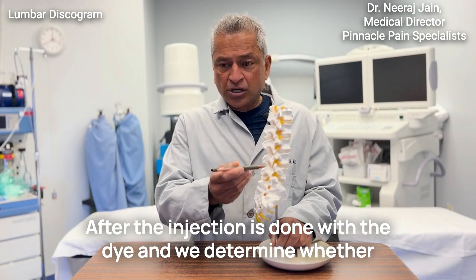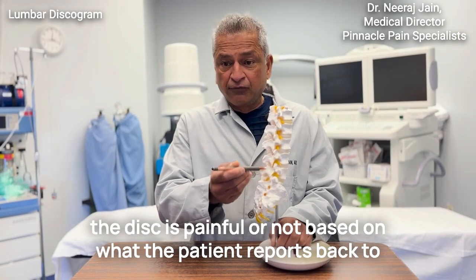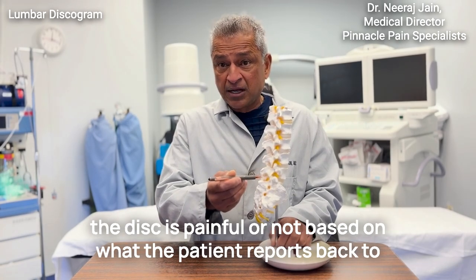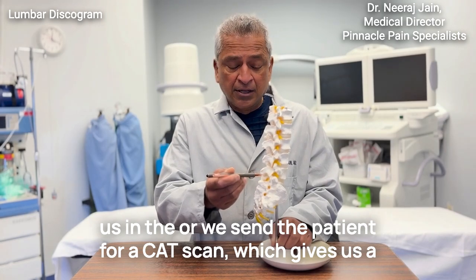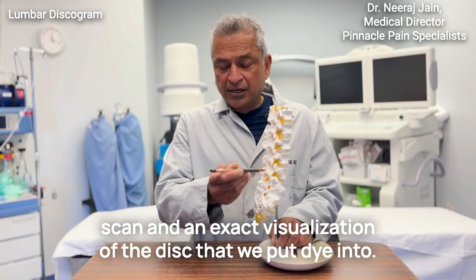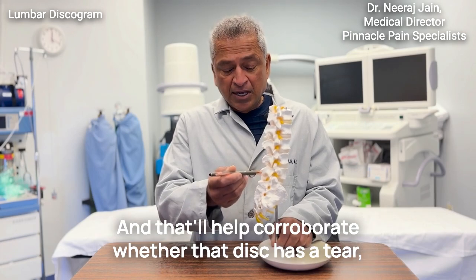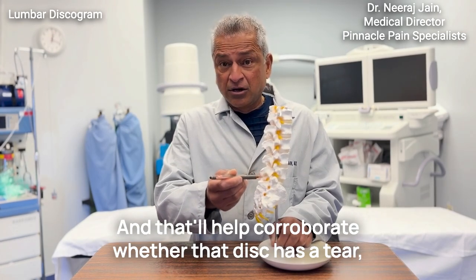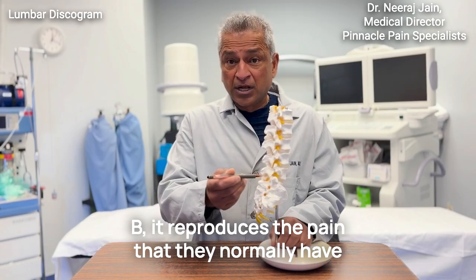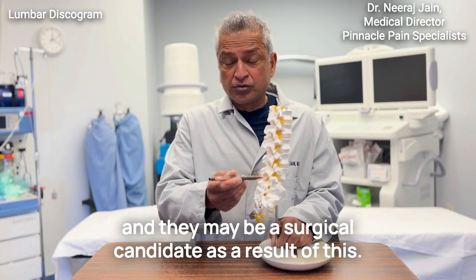After the injection is done with the dye and we determine whether the disc is painful or not based on what the patient reports back to us in the OR, we send the patient for a CAT scan, which gives us an exact visualization of the disc that we put dye into. That'll help corroborate whether that disc has a tear, whether it reproduces the pain that they normally have, and that they may be a surgical candidate as a result of this.